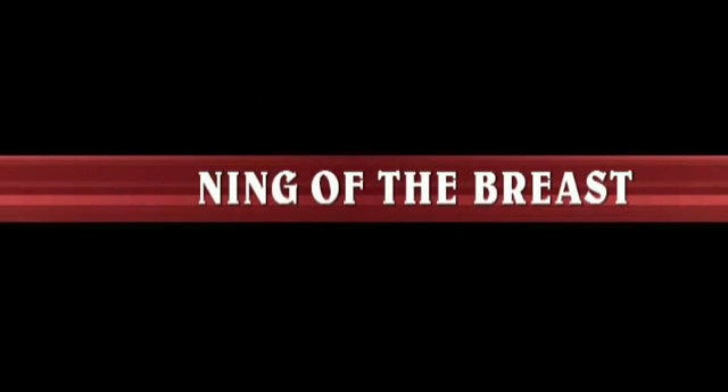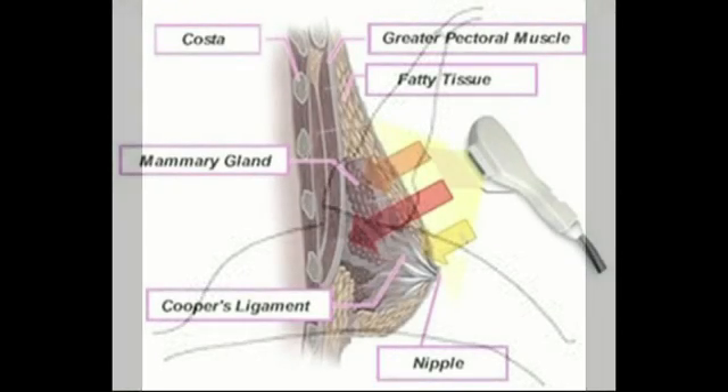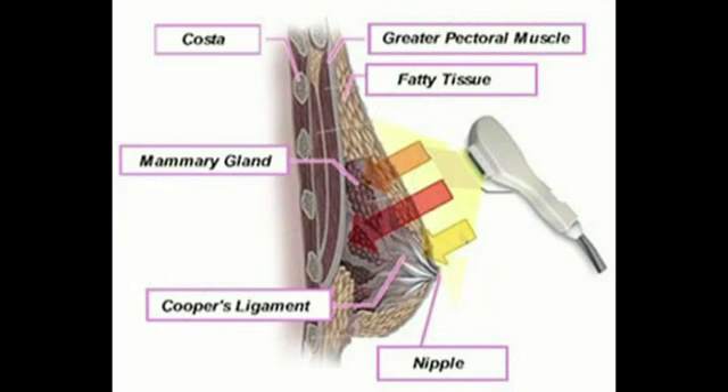Scanning of the Breast and Axilla. In real-time examination with a linear probe for breast scanning, we can only scan a slice of the breast each time. This slice is approximately 5cm long and only 1mm wide.